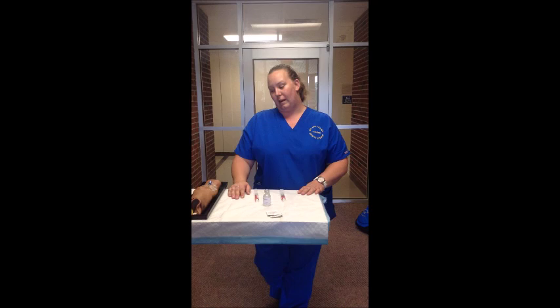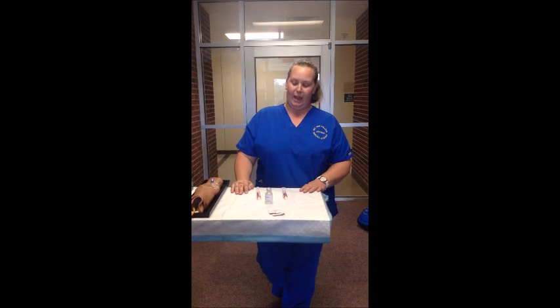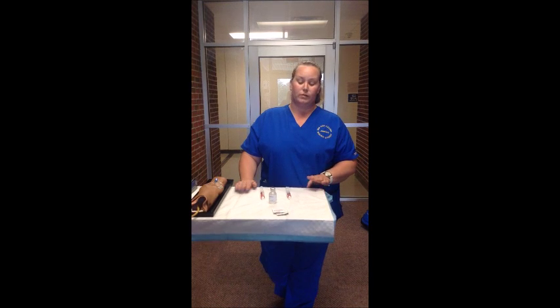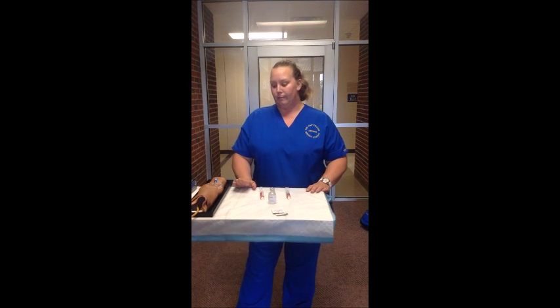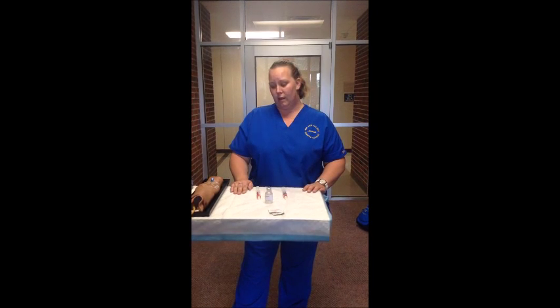Hi, my name's Jessica and I'm going to be your nurse. I'm going to have you verify your name and date of birth to me. And I've got orders from the doctor to administer 5 milligrams of morphine.